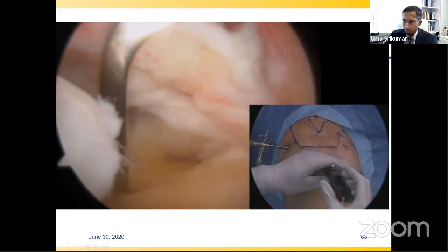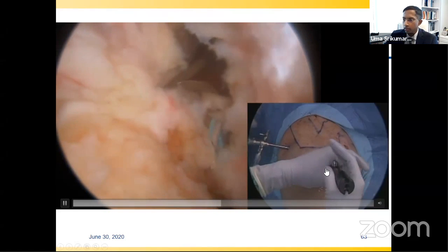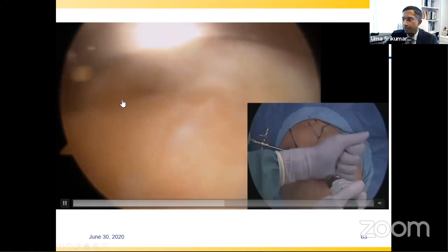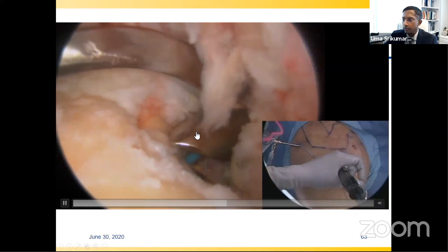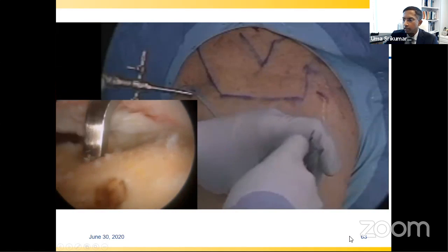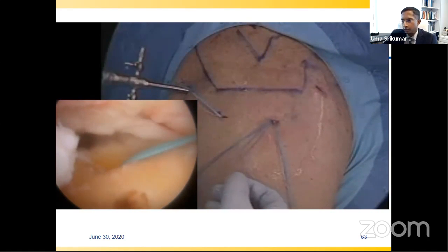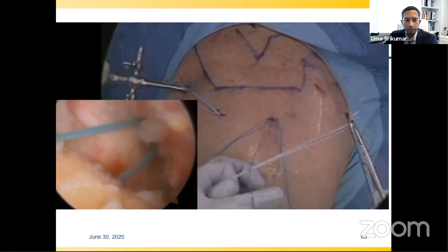The hook device again goes into that previously impacted pilot hole. You can see we're pushing down on the device to go get low. I'm going to push this hook into the tuberosity, impact it down. We use a targeting lateral device to find a good spot laterally, and then we start impacting the awl. The clips inside the hook self-grasp that passing stitch that the awl delivered, and again passing the definitive suture through this initial looped stitch.